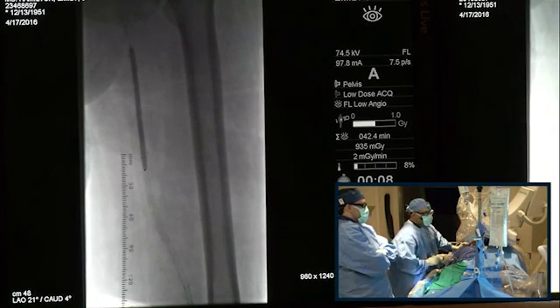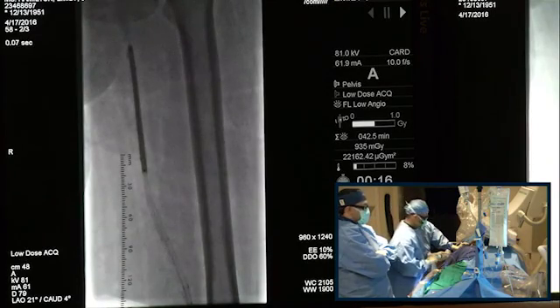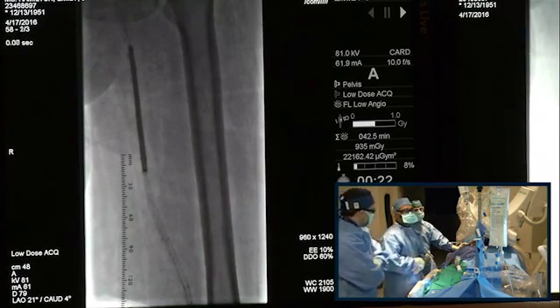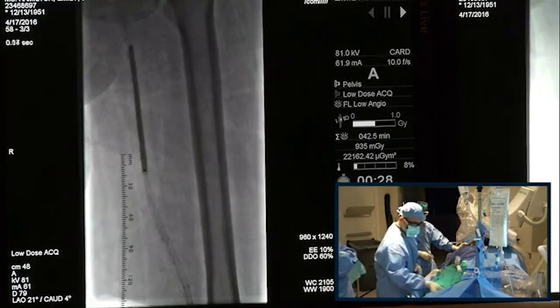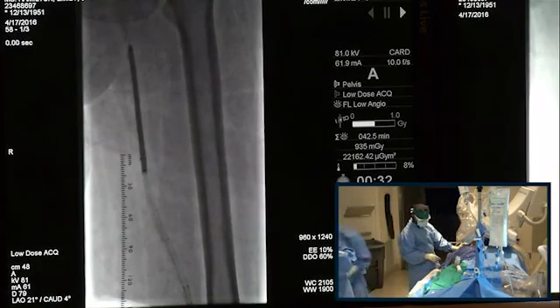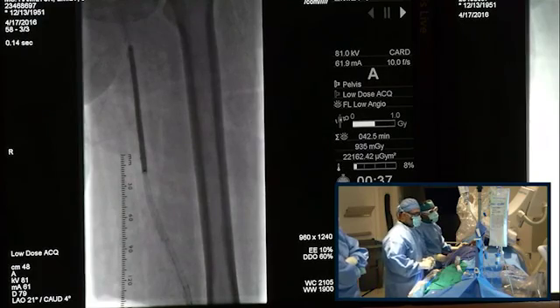So Alec has a comment regarding DCB use. No, I was just going to say that I'm not sure if it's necessary, but I can't argue with using it. I agree. No, Alec doesn't see the reason. I agree with using it, but I would use it slightly more distally, at a distal edge, not so much more proximally. The vessel looks to me proximally better. I'm more worried about the distal apposition and the distal disease.